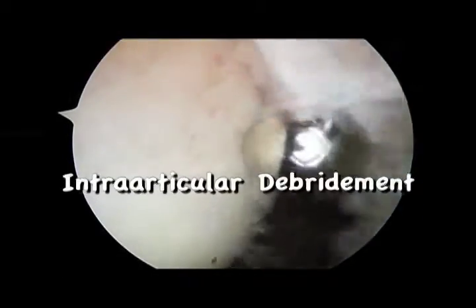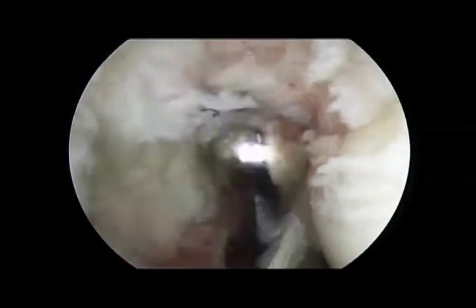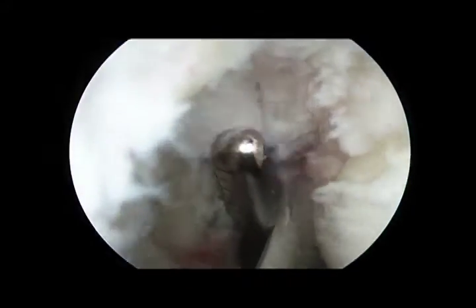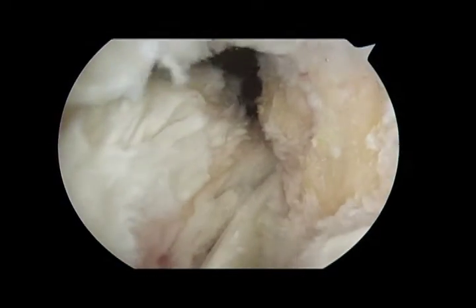We begin by performing an intra-articular debridement of the footprint on the greater tuberosity, as well as a debridement of the frayed and degenerative appearing tendon edge. This is performed from both the posterior and anterior portals and allows for a more thorough debridement than that which can be performed from the subacromial space alone. Here we see the completed tear and tuberosity after the debridement.